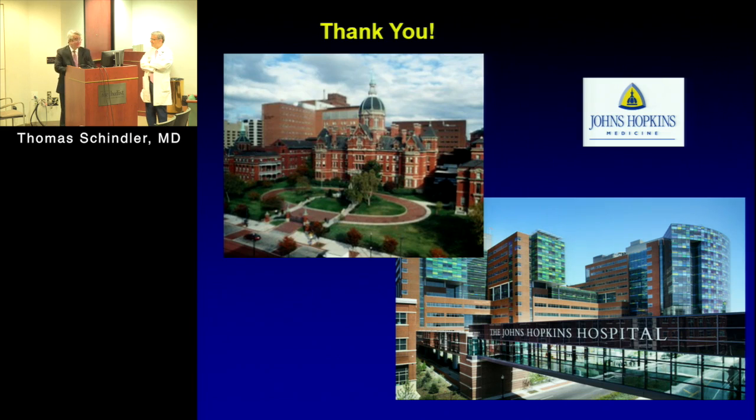When I see it now from my bias, and that's also what I tell my colleagues there, MRI delayed enhancement is fantastic after 3 to 4 weeks when you don't have any edema anymore. Then it's the method of choice. Or when you have acute myocardial infarction, and that has been shown by 2 groups in Germany and by Neubauer from Oxford, one of the good fathers of cardiac MRI, and they've shown that after myocardial infarction you have edema, and it takes at least 3-4 weeks to get it halved, and even 6 months for that edema to disappear.